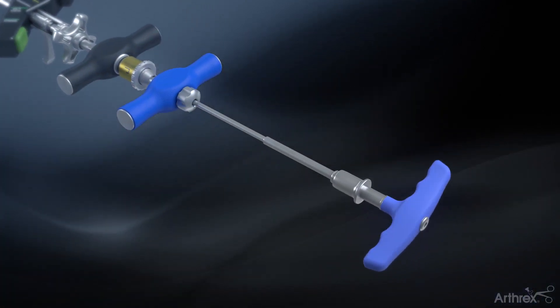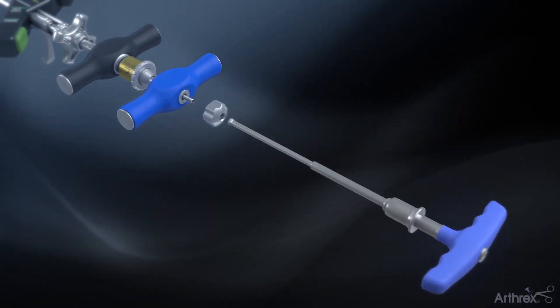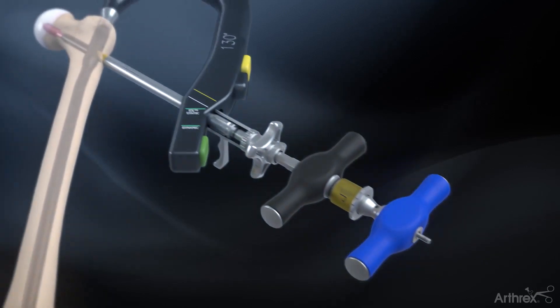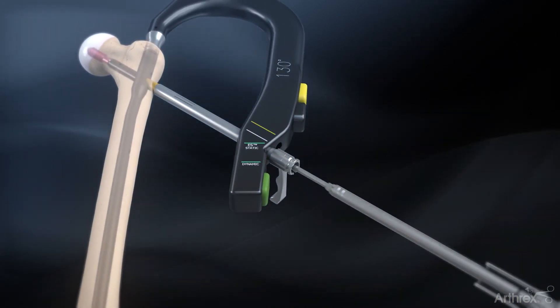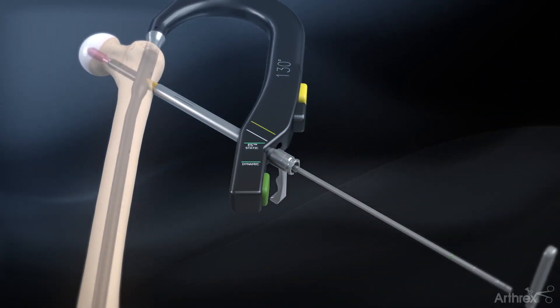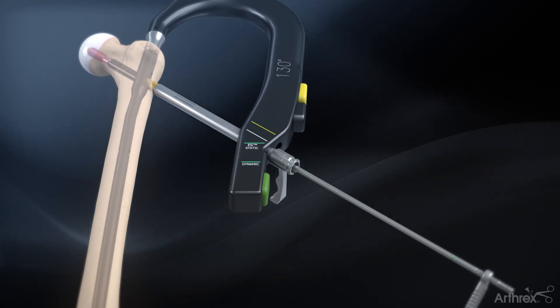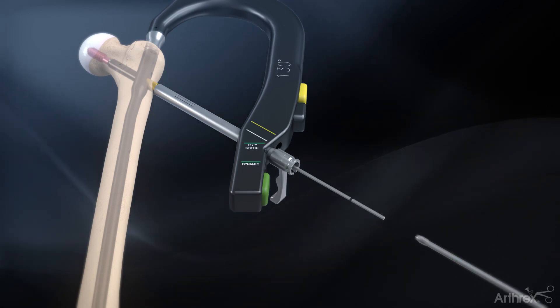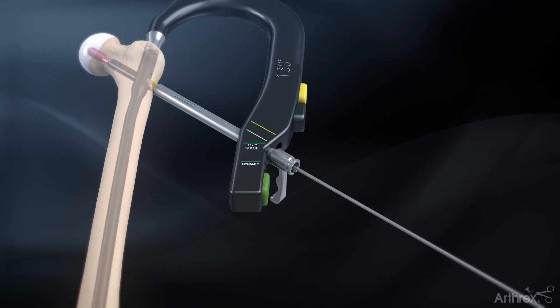Remove the lag screw capturing rod nut by hand or with the ball hex driver. Pull out the lag screw inserter assembly and unscrew the lag screw capturing rod by hand or with the removal tool. The lag screw guide pin is also removed.